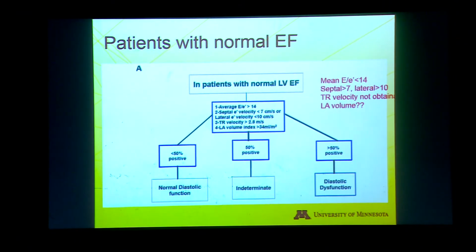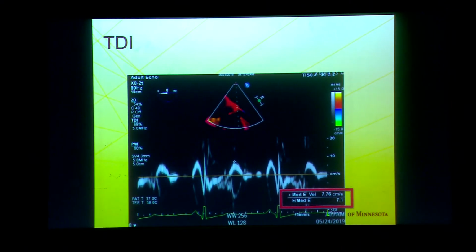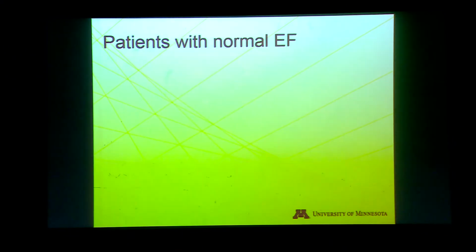So what we found here, let's go back here. The E prime is 7 for the septal, and it was 11 for the lateral.